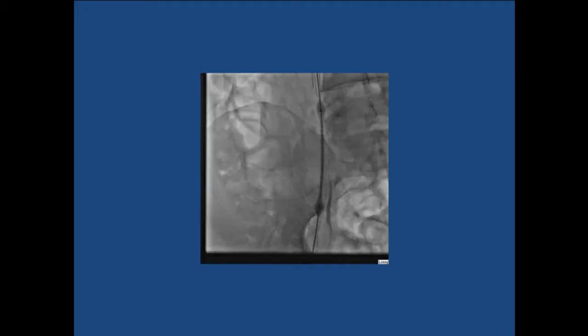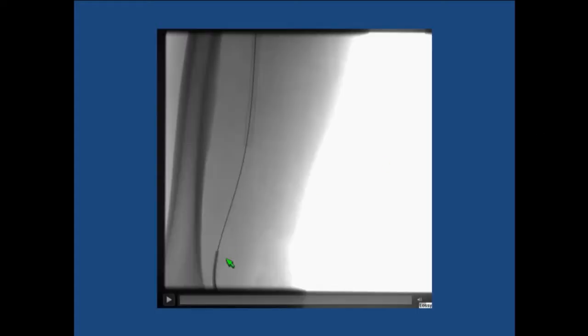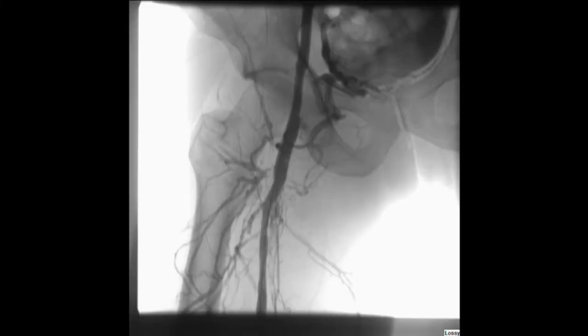We did not think that this was going to be adequate by itself, so we decided to stent all the way through this area. This is an image of an iCast covered stent, and then a second one overlapping in the mid part. Then we placed open cell stents at the superior and inferior margins of this area of interest with post-dilation. The balloon is still right here, which will show the final contrast injection after ballooning, stenting, and post-dilation ballooning, which shows some thrombus right there, but then following the true lumen up, it's much improved from what it was before.